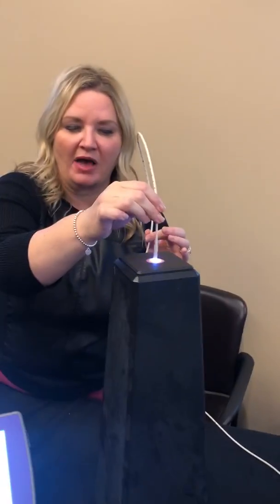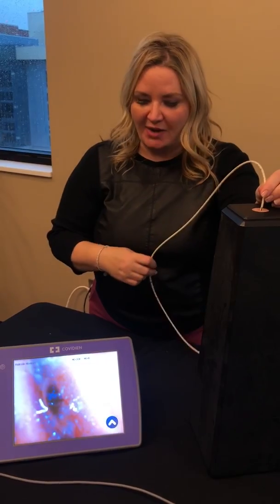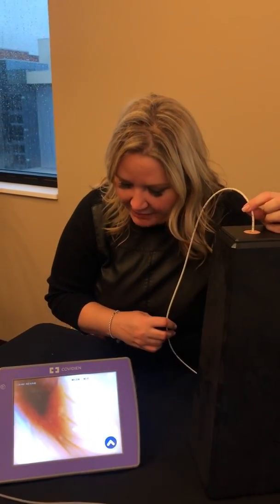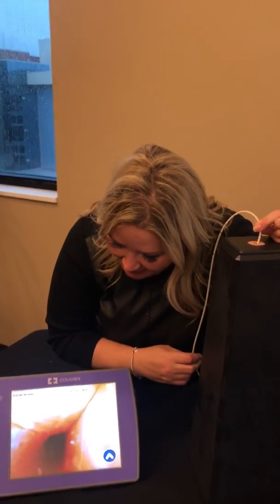So what I'm going to do is simulate placement using this model, and we're going to use the screen to identify different anatomic landmarks to indicate that we're in the right spot. I might need a little assistance because I can't completely see the screen from where I'm standing. What you're going to see as we enter is the vocal cords. What we're going to do is shoot for the esophagus. You're in there. Oh, we're in the esophagus, nice.